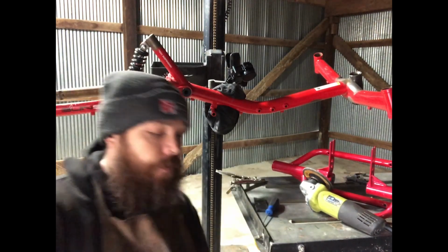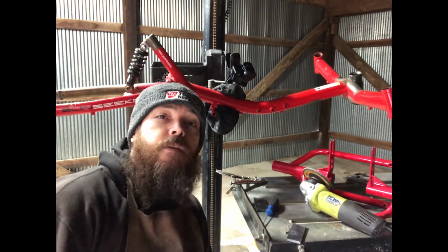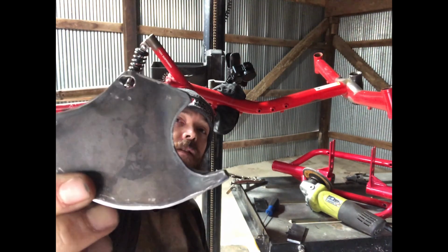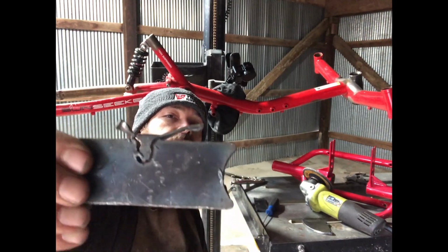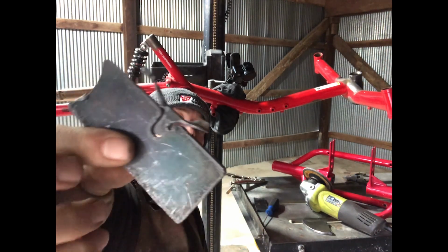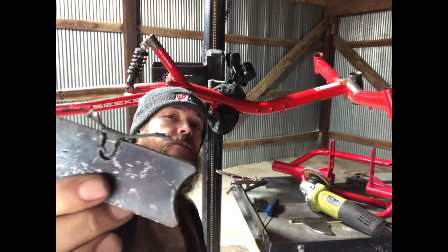Alright, so let's get going. If you haven't seen already, we got a CNC plasma cutter, and I'm able to do pieces like this. Coming out pretty nice. And then there's pieces like this that don't come out so nice. This is what happens when the plasma cutter decides to turn off on you because there's not enough air pressure.